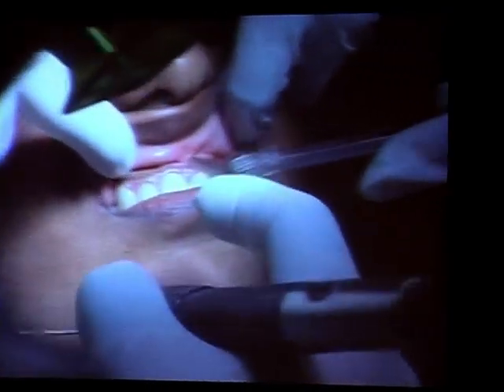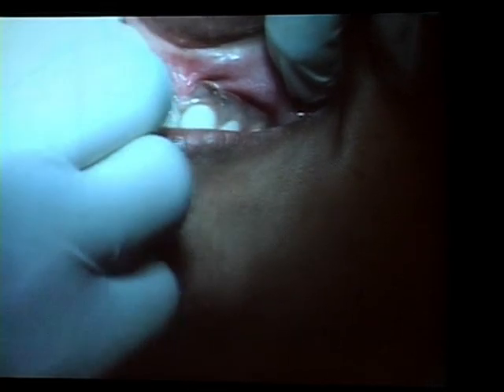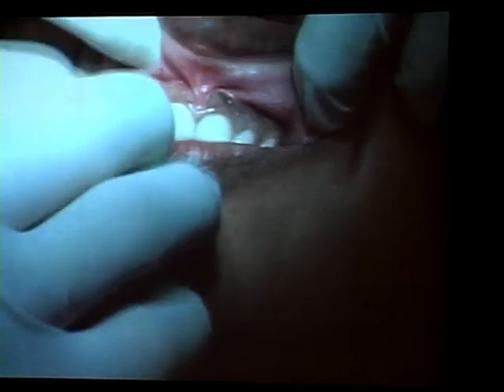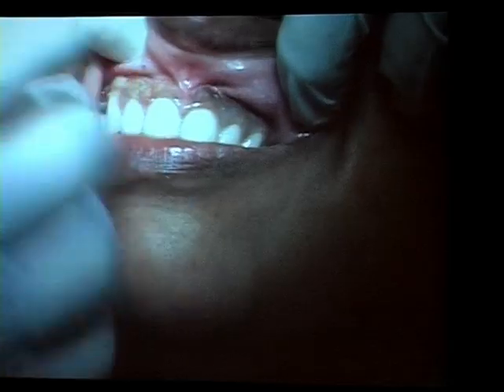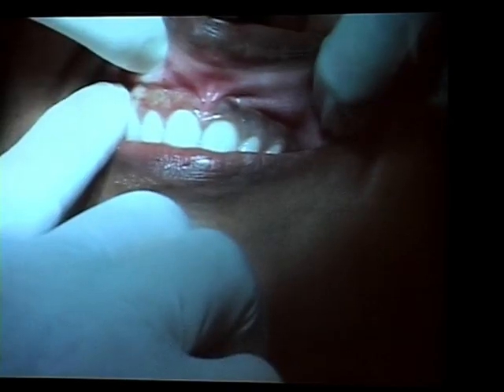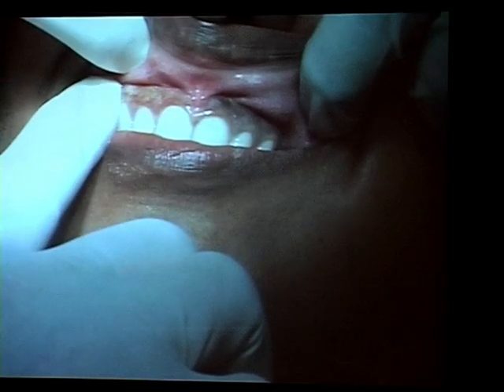There, we're nearly done now. So you see it's looking much better now. Very nice, Ralph. And I think we will compare it to the other side with another laser, okay? And 48 hours down the line, you'll see a little pink area there. If you feel the need to revise it a little bit, you can always do so. It's really not painful.